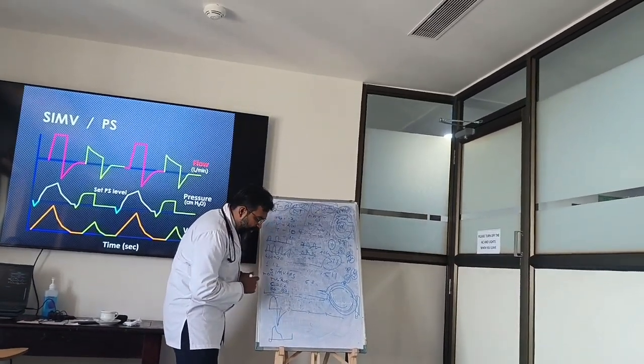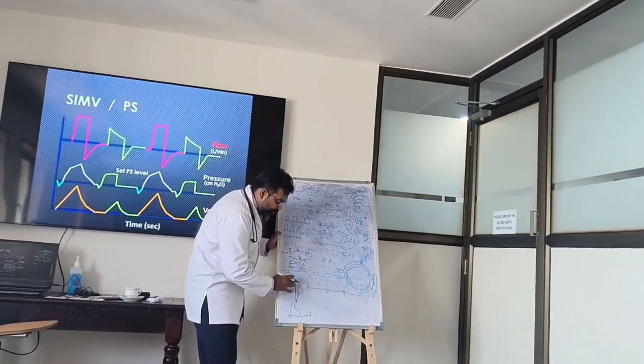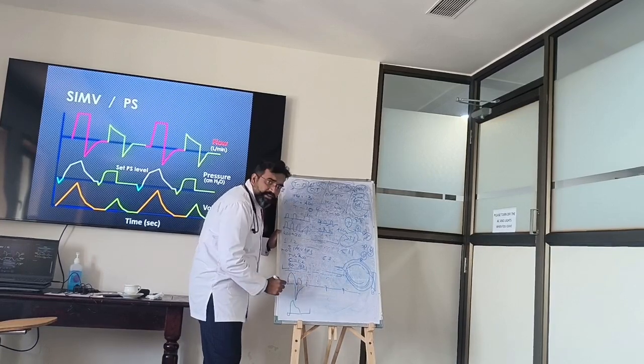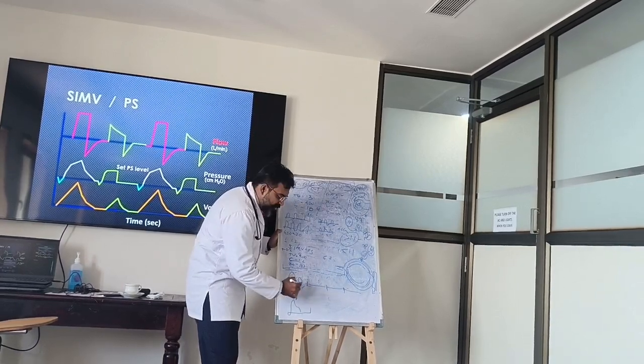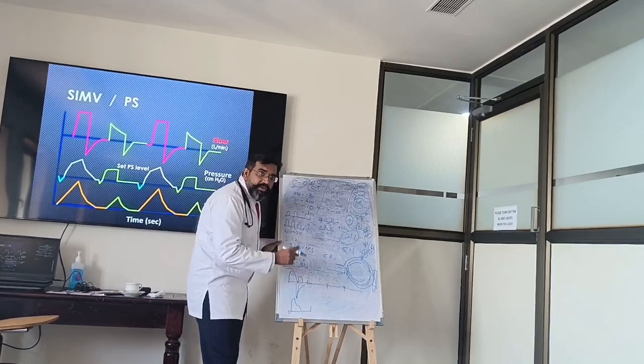Okay. Now what are we thinking, that it should close here, here, here. What will happen is, say for example, the patient takes an SIMV breath and takes another pressure supported breath. Okay. Then it will lengthen this part. So it is an algorithm.